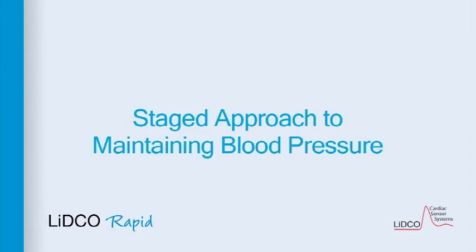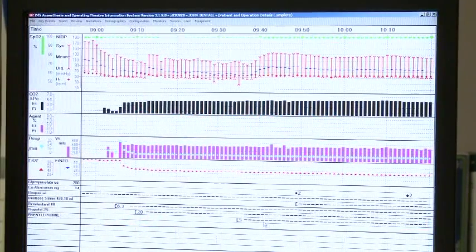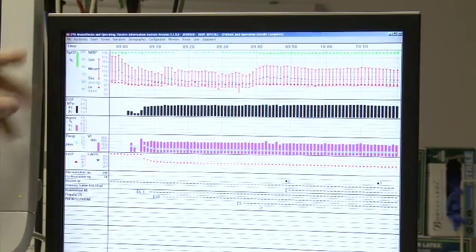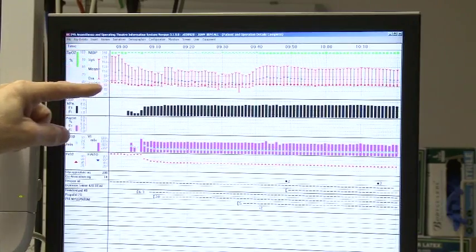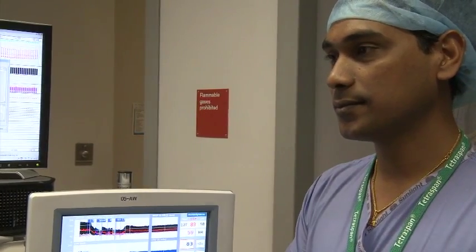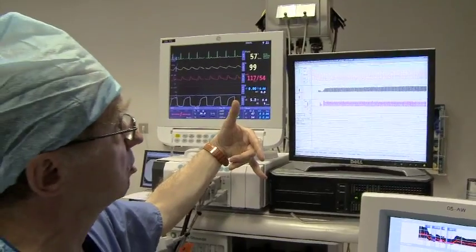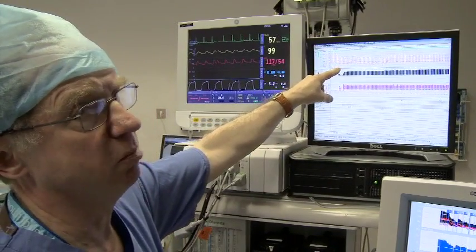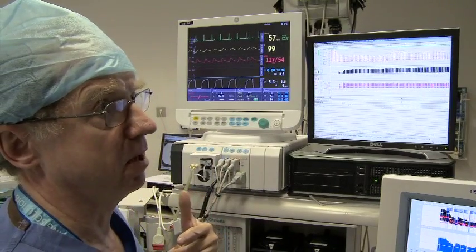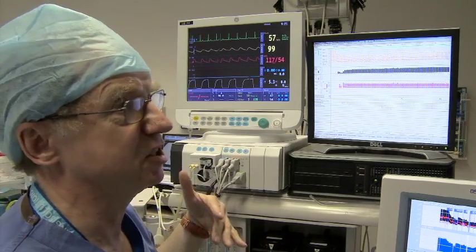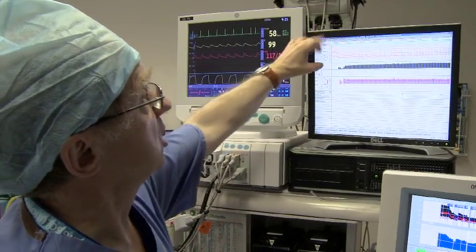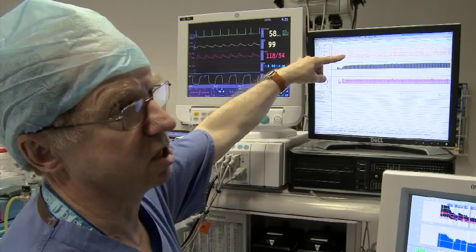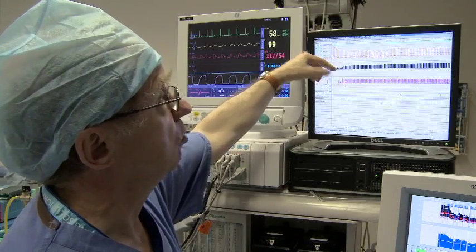With conventional monitoring, this is the history screen showing blood pressure at the top, and saturation in green running normally at 95 to 100. What we saw at induction was a fall in blood pressure. But with this monitor alone, we don't know whether that fall was due to a systemic vascular resistance change — in which case an appropriate intervention might be metraminol — or a fall in stroke volume and cardiac output, when metraminol would be an inappropriate intervention, because all it would do is increase systemic vascular resistance when systemic vascular resistance hadn't changed.